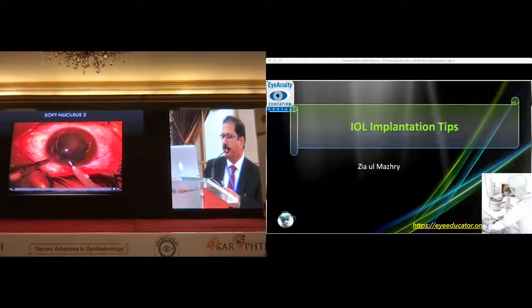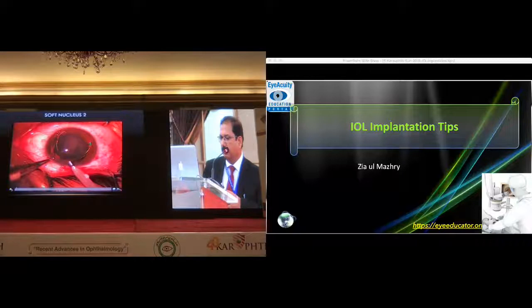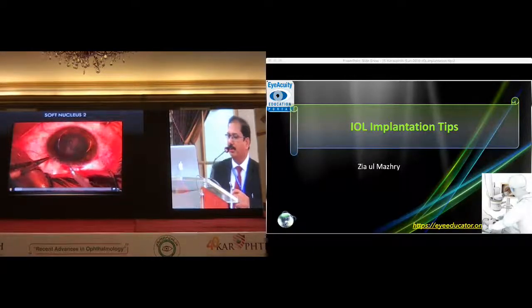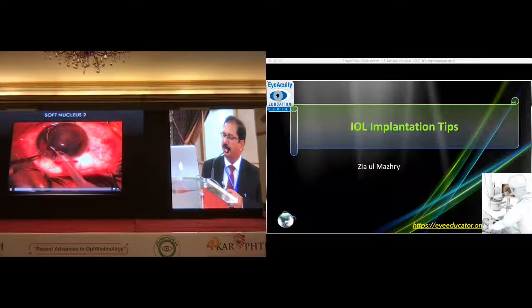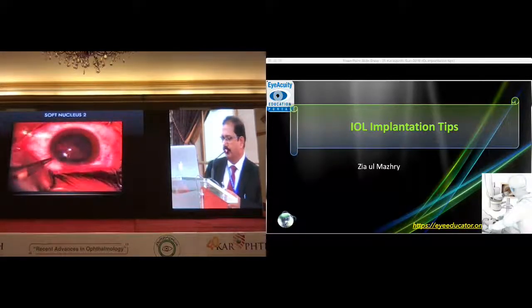The important thing is that you should remain towards the anterior chamber. If you engage the central area, then bevel towards the periphery. From the inferior port, we will be pushing the posterior capsule backwards. Here you can see that if you engage the central portion, there is tumbling and some difficulty. But don't worry — everything can be easily done even in cases when there is tumbling of the nucleus. The other hand is not used, and no more viscoelastic is used in these cases.